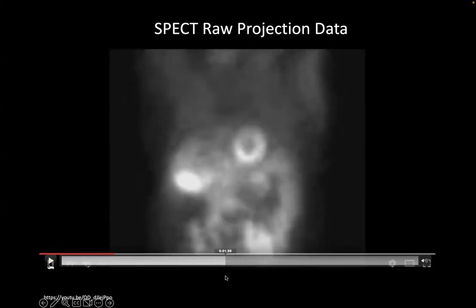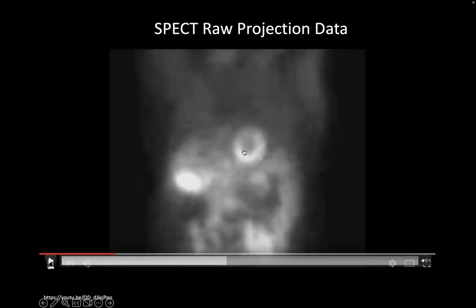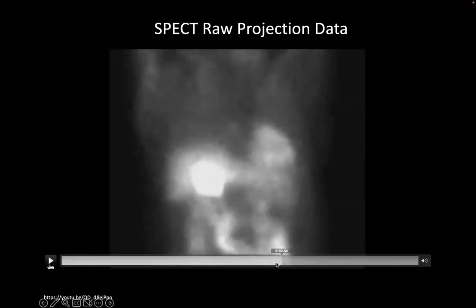When we look at it right down the barrel, this is kind of like a short axis view, but it's obviously dependent on the patient's orientation and the orientation of their heart and their chest. But definitely you can see down the chamber of the left ventricle here. Remember, this is brightness from all of the pieces of tissue that are perpendicular to this plane, integrated through the patient. It looks like there's fewer up here than down here, right? So there may be some kind of attenuation up here, but that attenuation, when we look at it and we say it's dark, could be from overlying structures as well. So we don't know until we do the three-dimensional reconstruction whether that darkness is from the myocardium or from overlying structures. But that's the raw data at different angular projections.